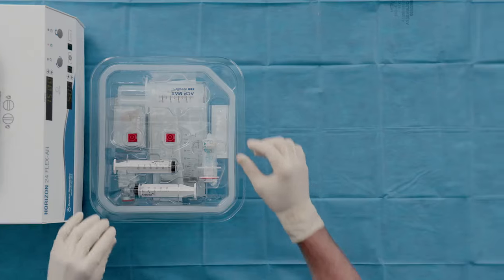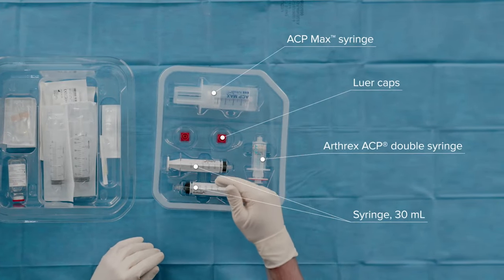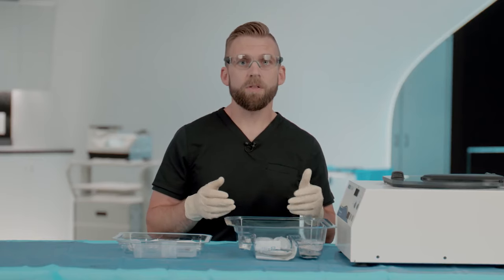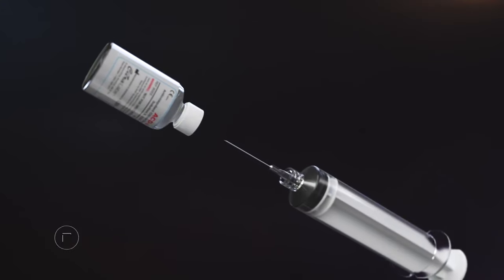The ACP Max system has two sterile package trays. The first tray contains the ACP Max and ACP devices, and two syringes for PPP extraction. The second tray contains all the necessary components for a blood draw. You have the option of drawing 30, 60, or 90 mLs.